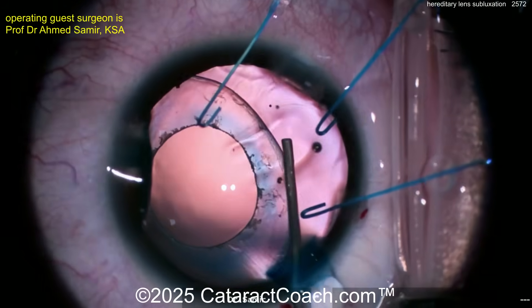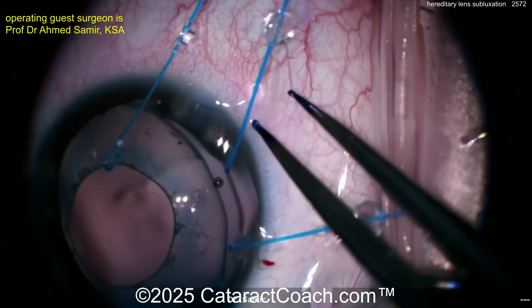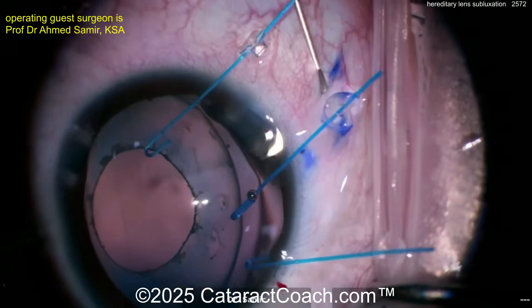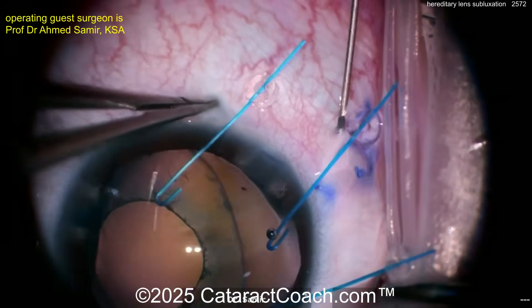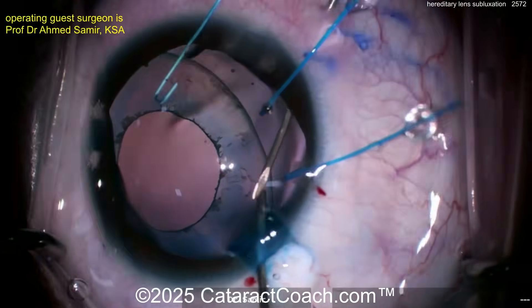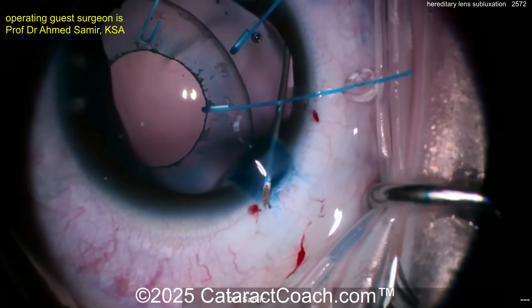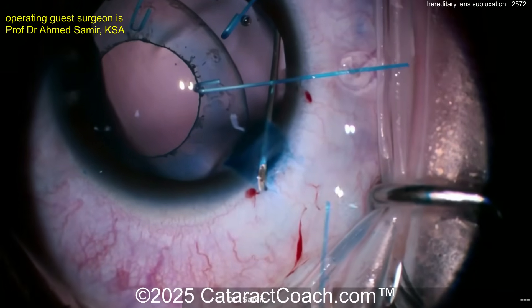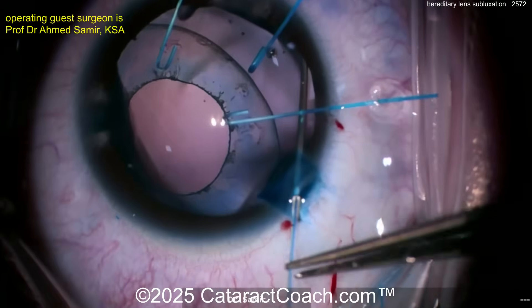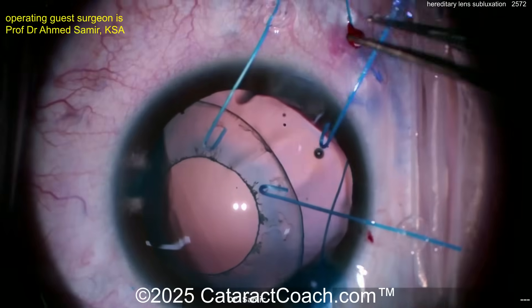Taking out the iris hooks now. We have a nice empty capsular bag, thick vitreous, and an intact anterior hyaloid face. Measuring back — looks like two and a half millimeters — probably doing a Yamane-type technique. Getting inside here, bringing that hollow bore needle outside the main incision. It looks like a suture — looks like a prolene suture, probably 6-0 prolene — so maybe some sort of flange technique coming up. Threading that through and pulling it out.